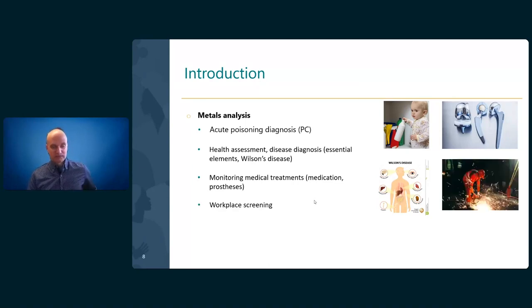Also, we perform analysis for metals in a workplace screening scenario. So we know workers could be highly exposed to different contaminants, including metals. So for some companies, we are doing a kind of regular checkup to make sure that those workers are not too exposed, and so they don't need to be retired from the field.